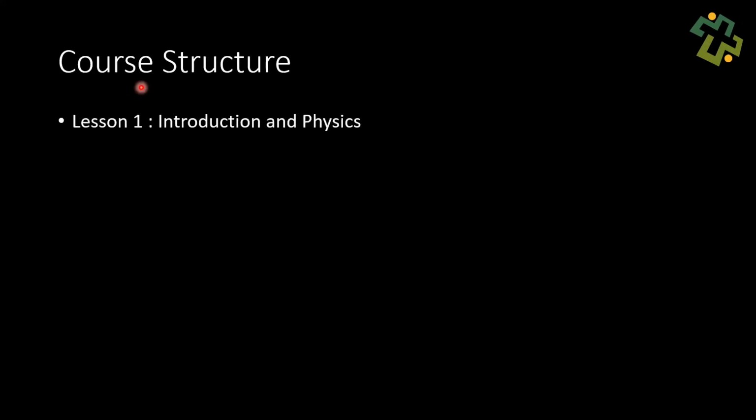Okay, so this is what we're going to cover, guys. We have 9 lessons, and then we get into the quiz. So the first one is introduction and physics. Here we're going to cover the fundamentals of how an X-ray is taken and the physics involved. Like we said in the info session, don't let the word physics scare you away. It's really basic and includes some very pretty pictures.